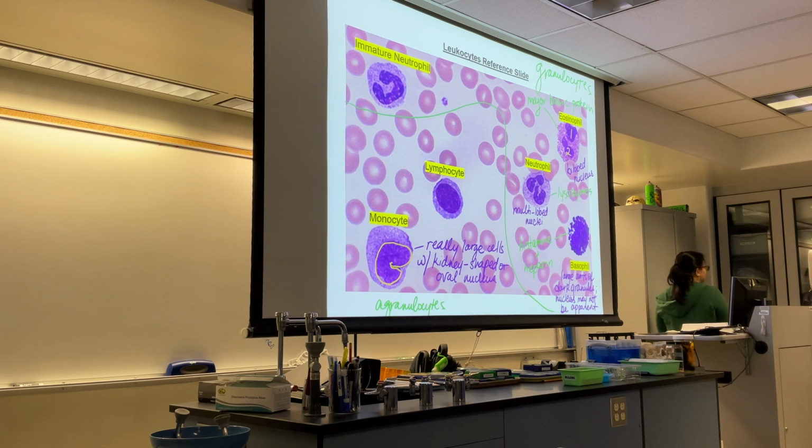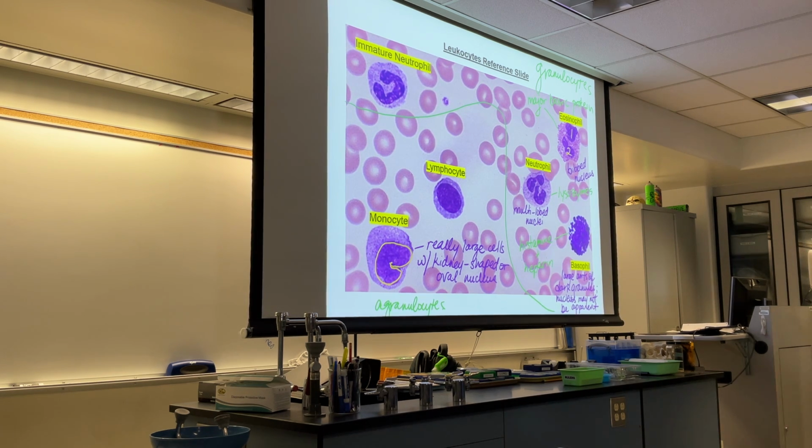Does anybody remember what monocytes become when they mature? Macrophages. So monocytes will become your macrophages. I'm giving you a lot of the potential questions that you could be asked, kind of like an addendum to your lab practicals. But remember, all of this information is also relevant to your lecture. Have you guys noticed that even though the majority of your questions in your lab practicals are ID questions, there may be a few where I say, identify this part, and I'll ask how do you know, or what is the function of this part, and so on. I am giving you that information right now.